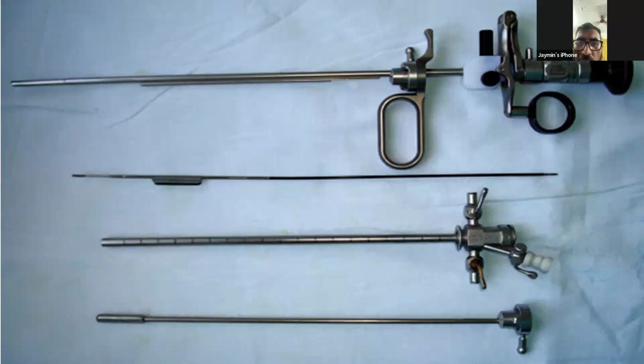It's a passive working element, sir, with a telescope attached to it.